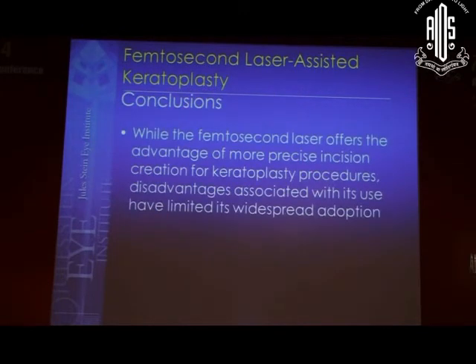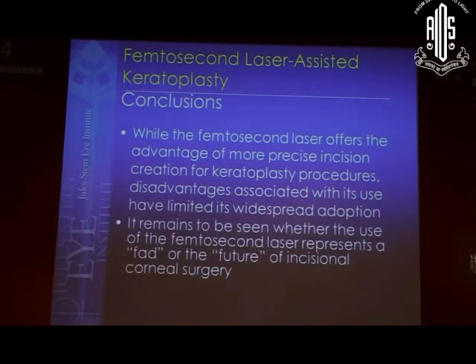So in conclusion, while the femtosecond laser offers several advantages, such as more precise incision creation, the disadvantages have really limited its use both in the United States and I think internationally as well. So I think right now it really remains to be seen whether this represents the future of incisional corneal surgery or just a passing fad.